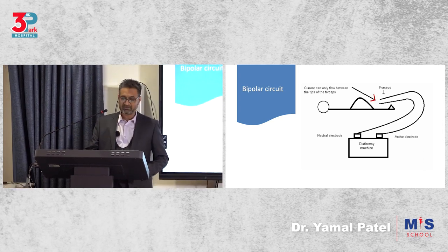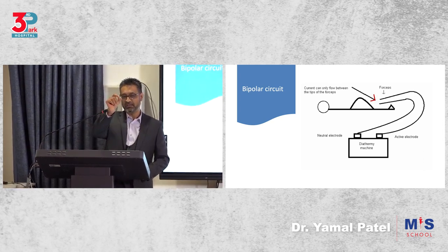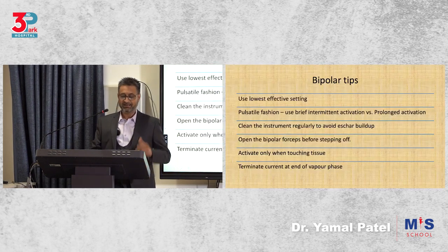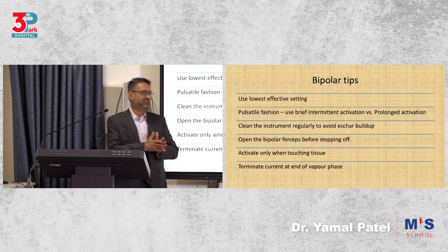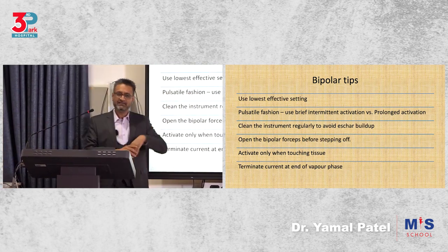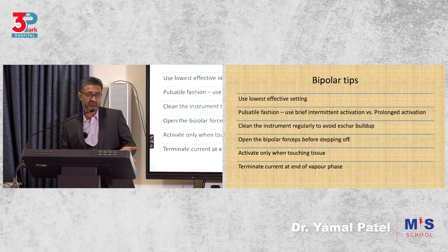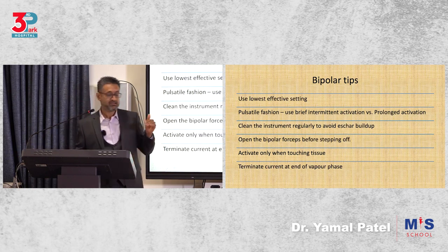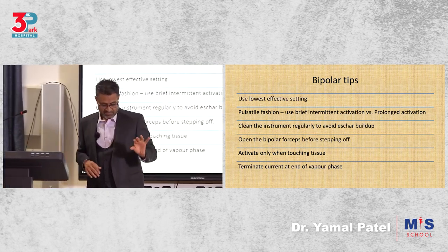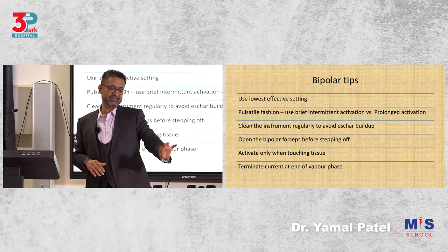Bipolar, we all know about it. It is safe because it's only between these two. It's not coming out through the patient. But the tips again, lowest effective setting, don't go high. If they say you work with 30, but you're getting a good effect with 20 or 25, work with 20 or 25. You don't have to go for 30. Pulsatile, don't activate by holding.